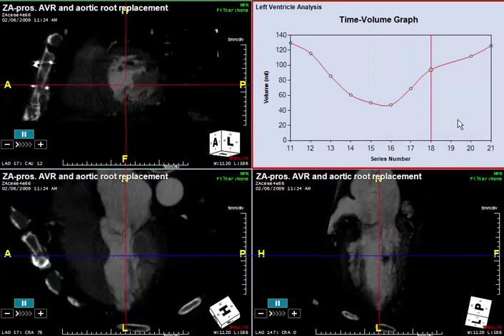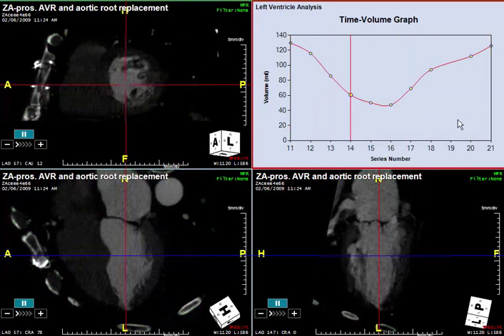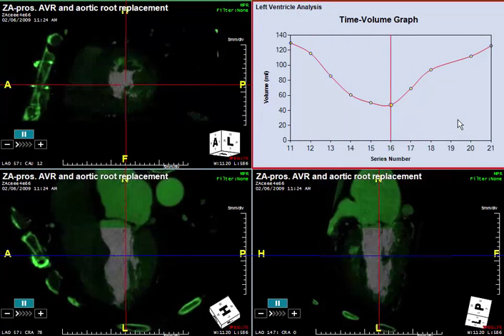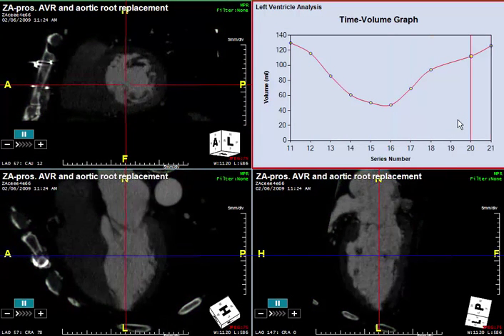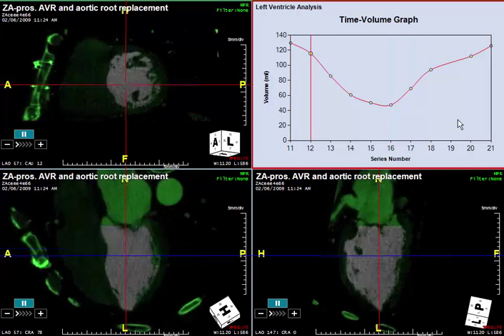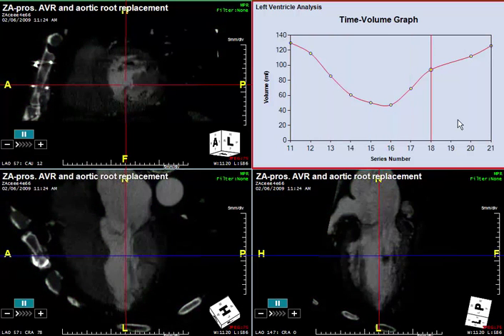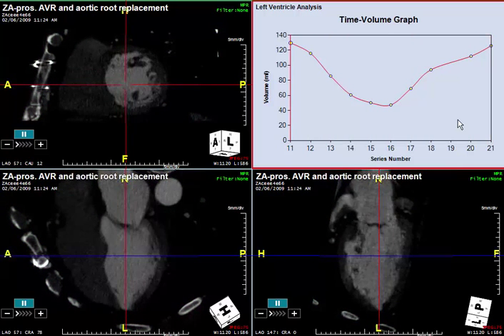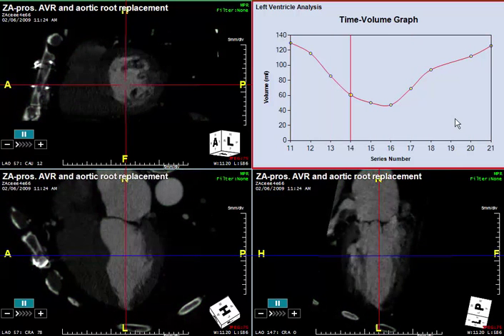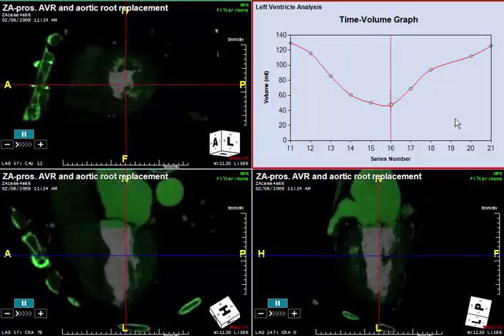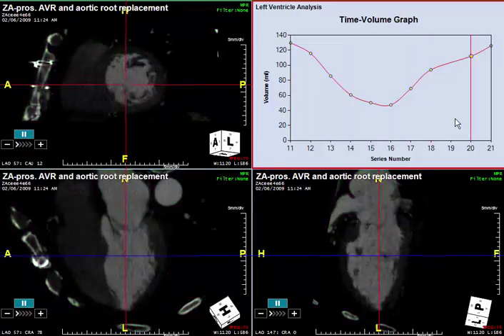We can also look at changes of time and volume. This is the LV time-volume curve, reminiscent of what we used to get in the cath labs. You can see good systolic function and, most importantly, good diastolic function.